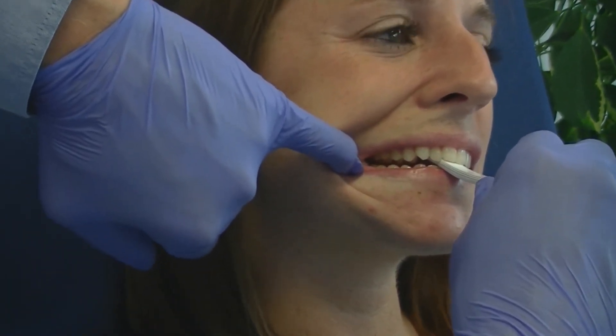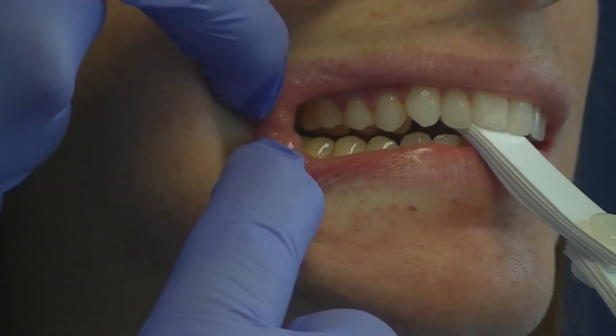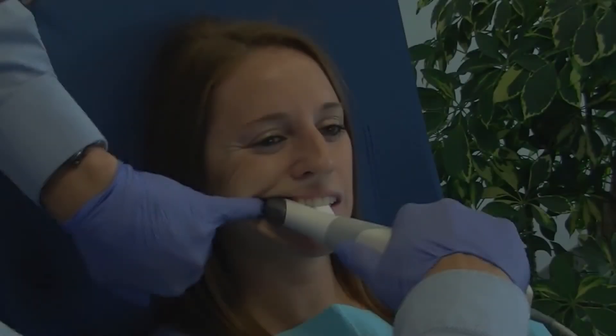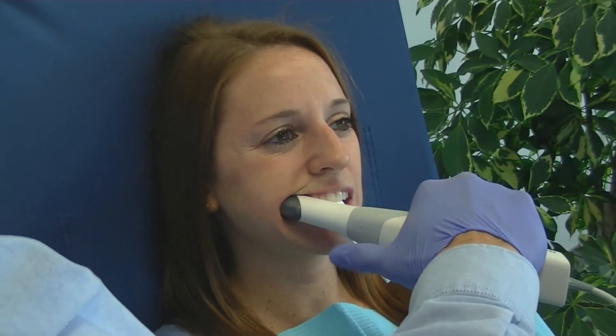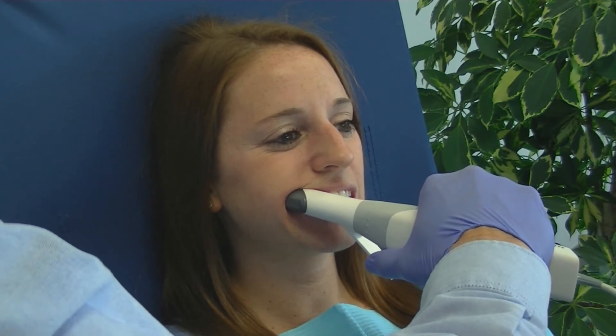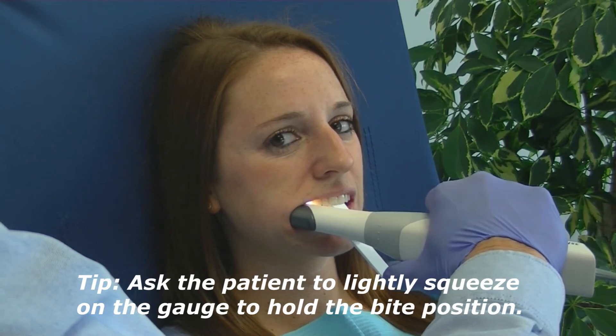Once no tension or tenderness is recognized, the joint is in the properly seated position for splint therapy. Insert the tip of the scanner wand and proceed with the bite scan. Have the patient lightly squeeze on the gauge to make sure they hold the bite position in place during the scan.